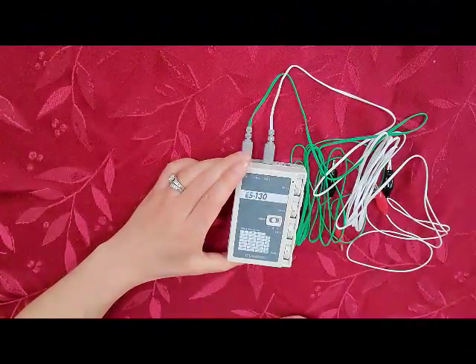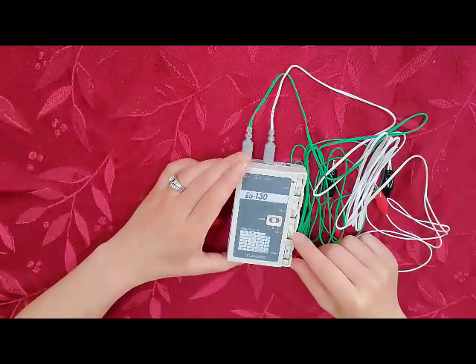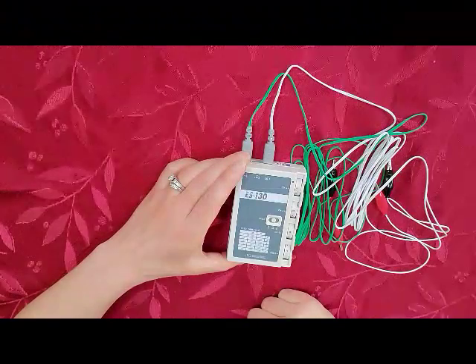And then now we are ready to begin our treatments by, again, very slowly adjusting the amplitude using the appropriate channel dials. And that is how you set frequencies on the ETO electrostimulator.